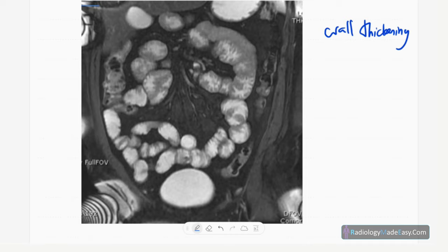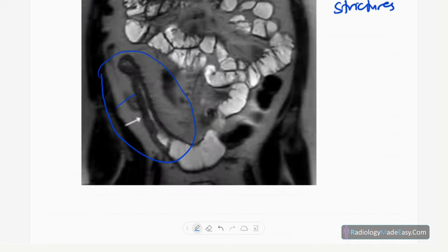Another enterography image shows terminal ileum involvement in Crohn's disease — stricture formation, bowel wall thickening, and some fat stranding are visible. This is an example of terminal ileum involvement on MRI enterography in Crohn's disease.